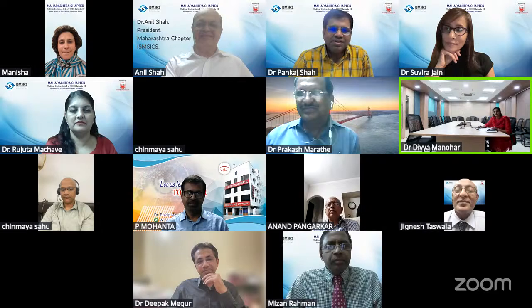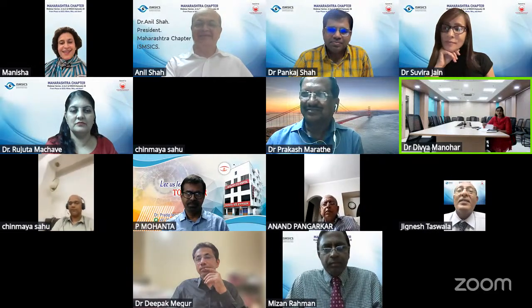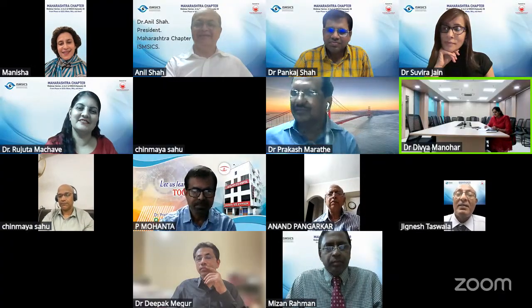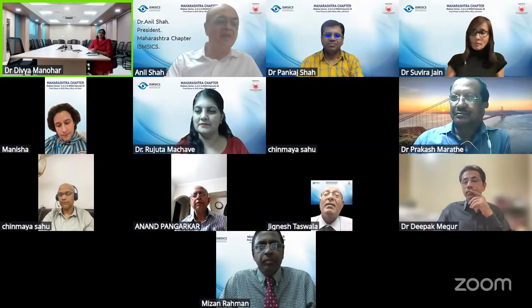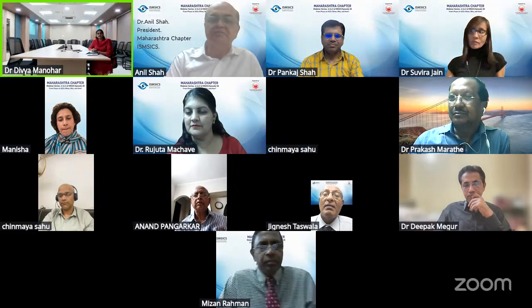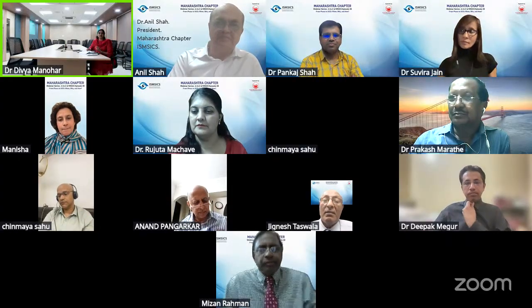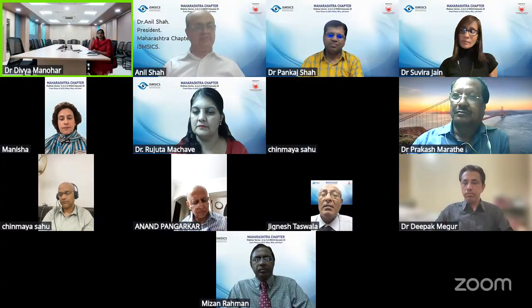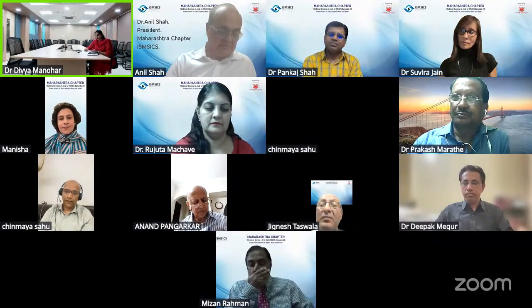Yeah, after Dr. Manisha Madam's expert comments, I'm wondering if my notes actually make any sense now. One tip I would say is using adequate viscoelastic before you remove the phaco probe. When you know there is a PC rent or PC dehiscence, I think it is mandatory to inject visco and gently come out, and not just come out all of a sudden, because that can cause sudden decompression and your nucleus can drop. So that is one tip that I would tell all the beginners.